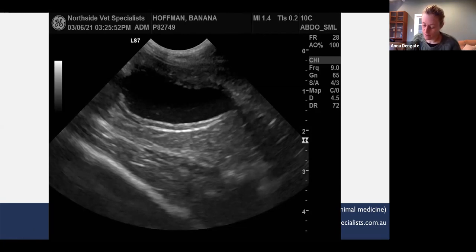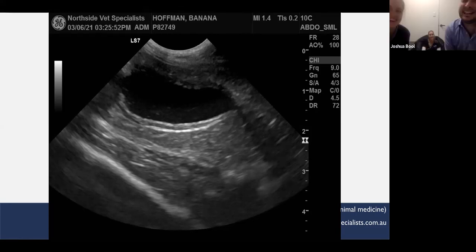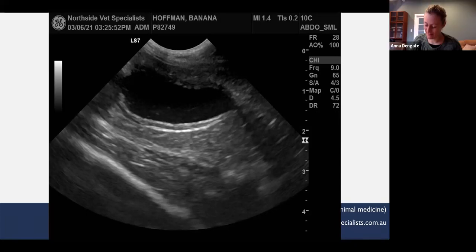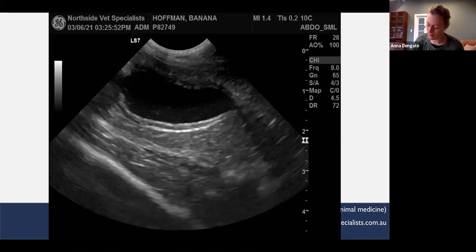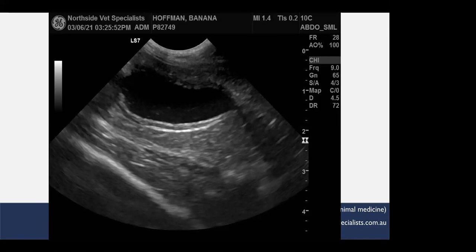So what are the differentials for gallbladder wall edema? Anaphylaxis. Pericardial effusion. Good. Right-sided heart failure. Good. Another one that's really a bit bizarre, isn't it? I missed that one, the adhesion one. What was that? Anaphylaxis, I got that, but something adhesion. Effusion. Pericardial effusion. Oh, effusion. Yeah.